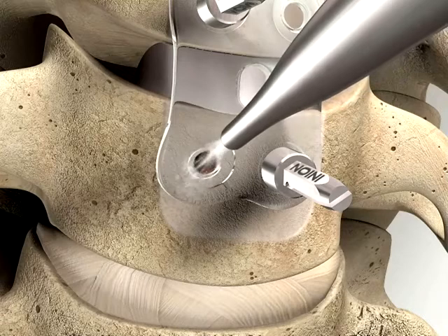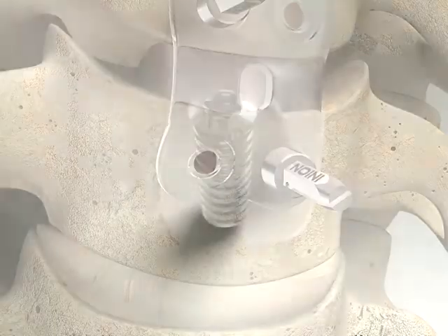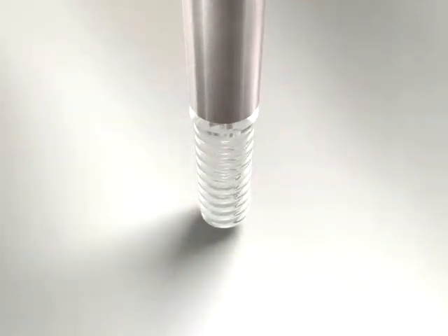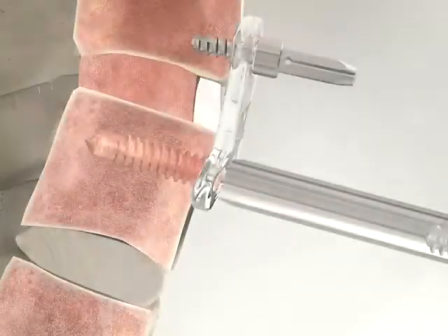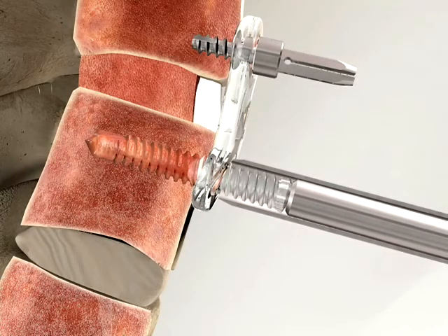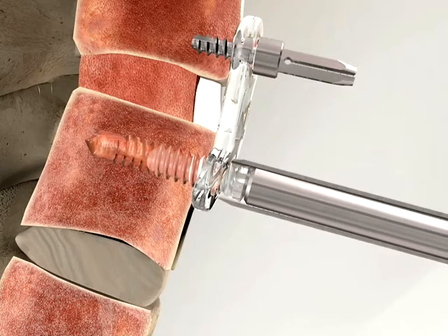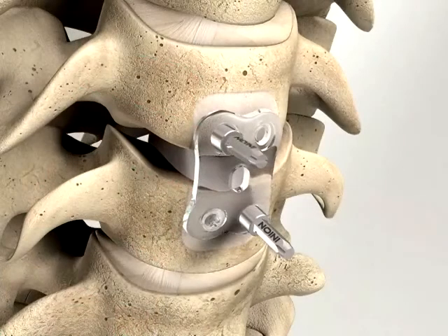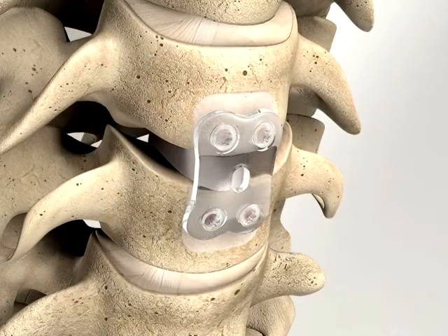Remove the temporary fixation screws and insert the final screws using the Inion screwdriver. A squeaking noise can be heard when the screw is locked to the plate. Continuing to turn the screw will risk stripping the screw socket. However, in case this happens, the screw can stay engaged as this will not compromise the fixation strength, as long as the screw is fully inserted.